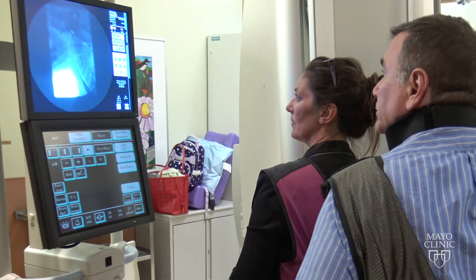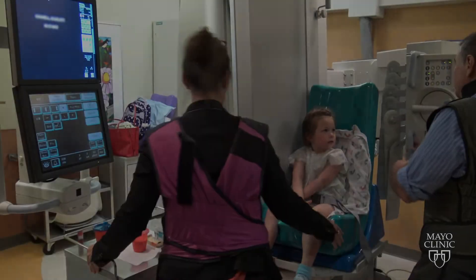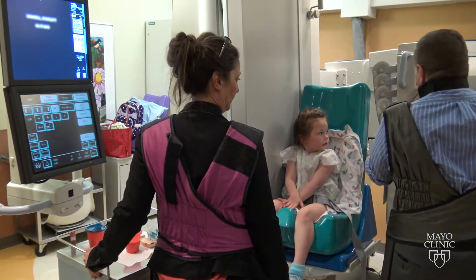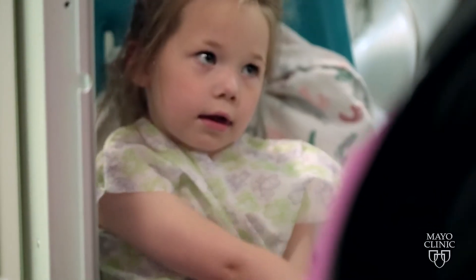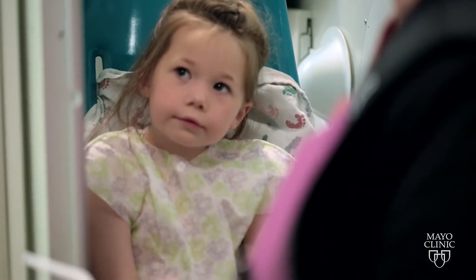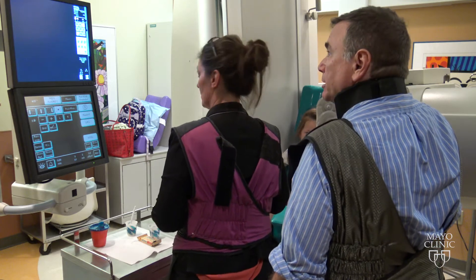I'm Carrie from Speech Pathology. I'll be doing a video fluoroscopic swallow evaluation, looking at a patient's swallowing mechanism under x-ray. I'm just going to be taking some pictures of you, and this is the camera that we use. It won't touch you, it won't hurt you. It does make a noise if it clicks into place, and your pictures are going to come up on the screen here. It's important that you're really still and straight when you're taking them.